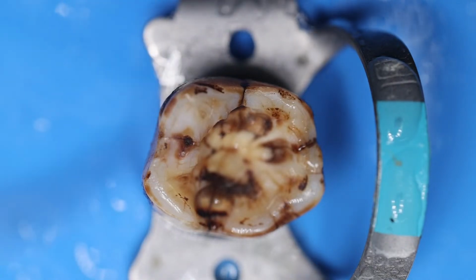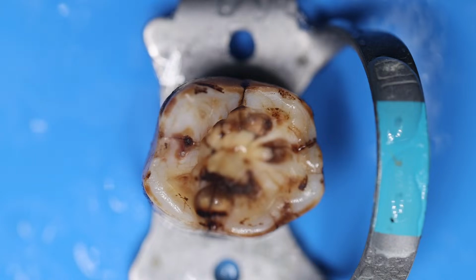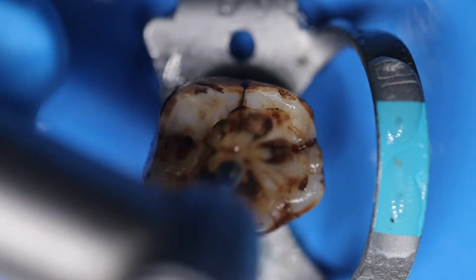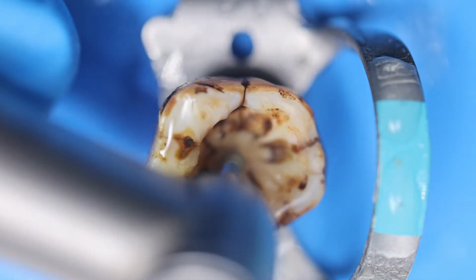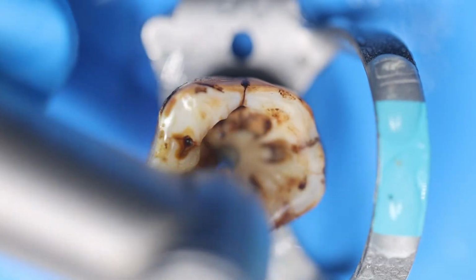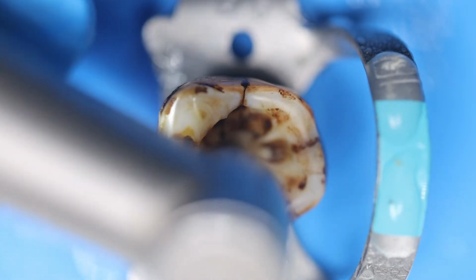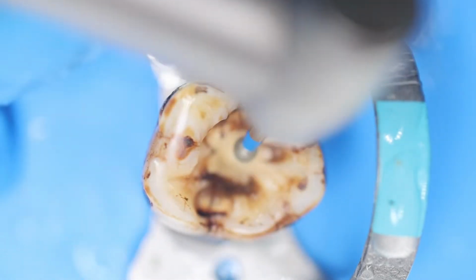Still we are at the center, so we are just creating a depth over here. This is the area where we are creating a depth. Go slowly. Do not just puncture one area. Just try to create a depth over here.